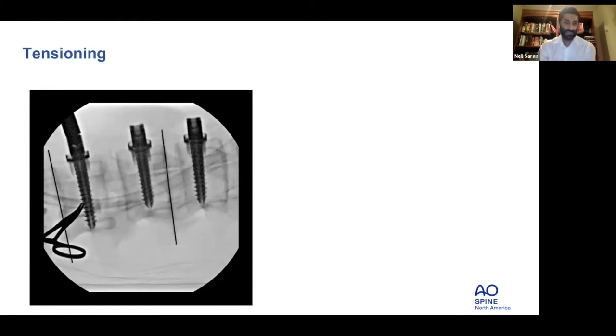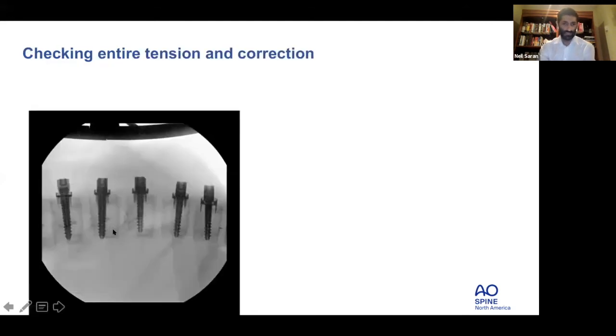The other thing I look at is the vertebral body wedging. So if I have more wedging, if this angle is more than I want, then I'm going to overcorrect this disc a little bit, based on where I want to set this patient at the end of the case.